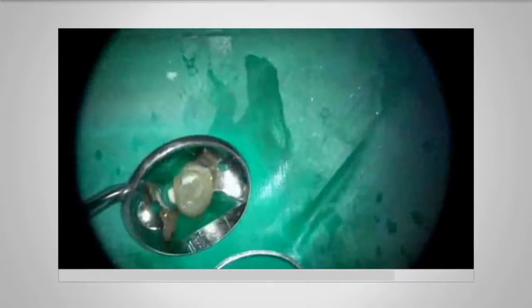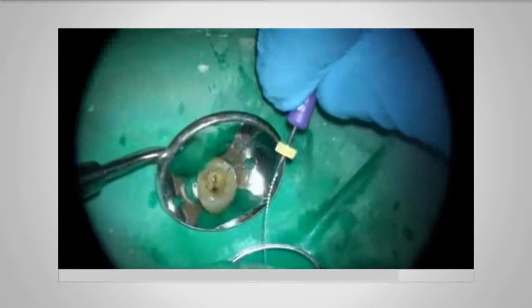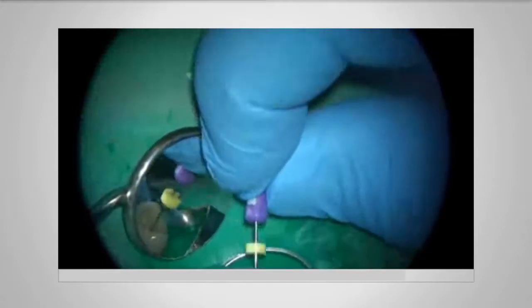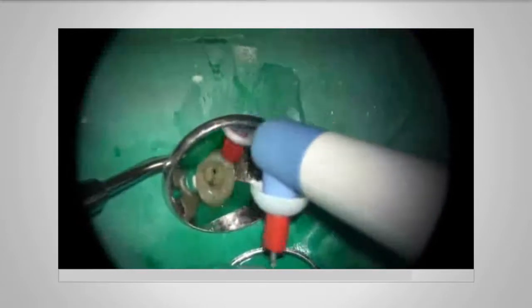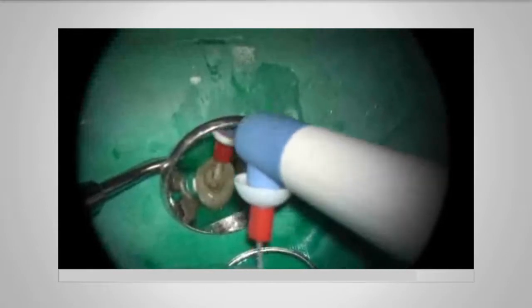Check for patency with my size 10 flexor file. And now I'm in the irrigation phase of the treatment. I'm using an EndoActivator to agitate the sodium hypochlorite in the root canals.